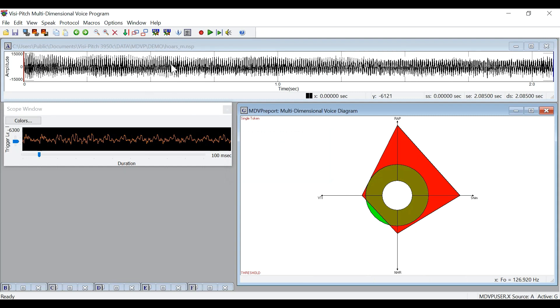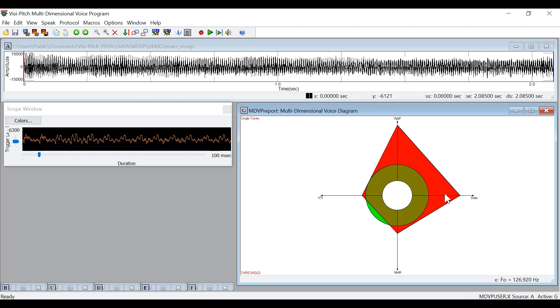You heard the program play the sample back and then complete the MDVP analysis. And as you can see, all of the values are outside of the normal range for this sample. Relative average perturbation and shimmer are way out of the normative values, while noise to harmonic ratio and voice turbulence index are slightly out.